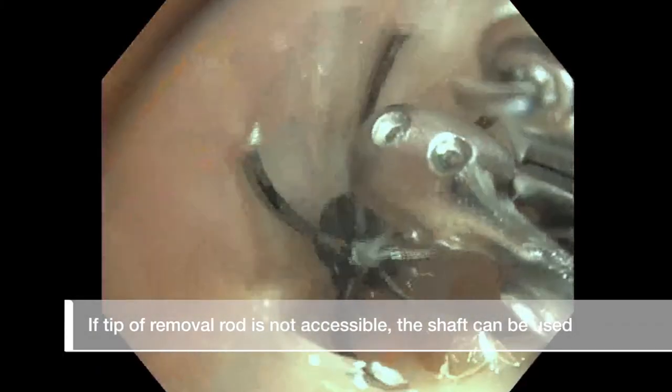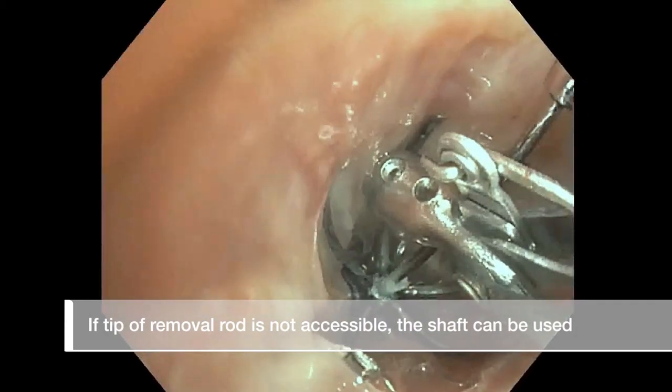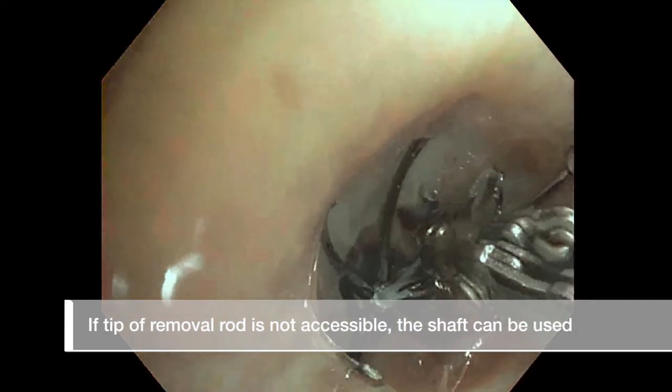In the event the removal rod tip is not easily grasped, the shaft of the removal rod can be used as an alternative.